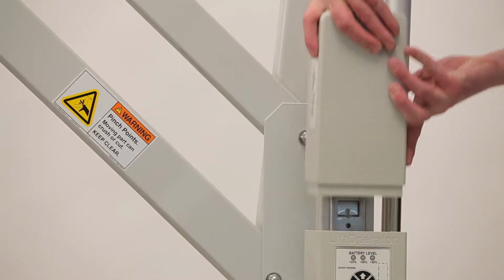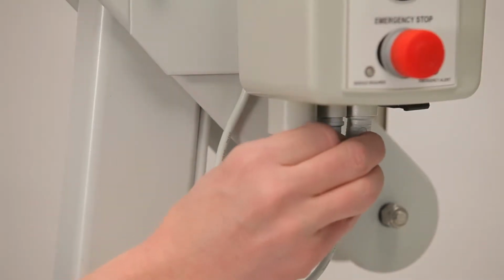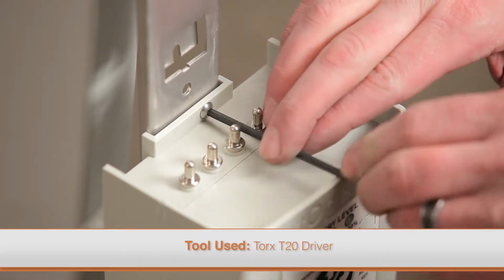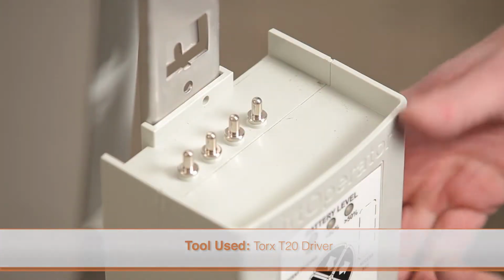To replace the control box, remove the battery, then all of the cables. Remove the Torx screw on the top of the control box using the appropriate driver. Slide the control box up and off of the mounting plate.